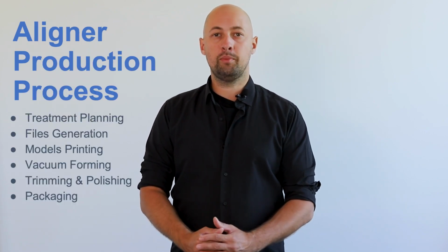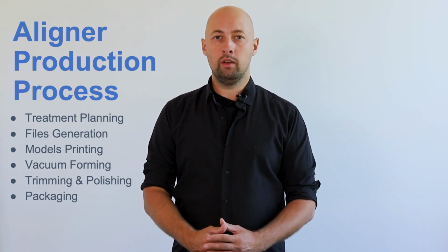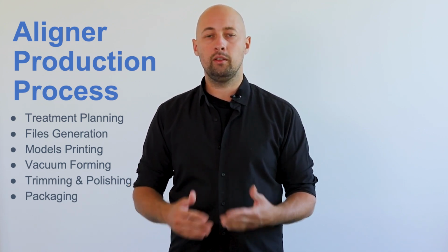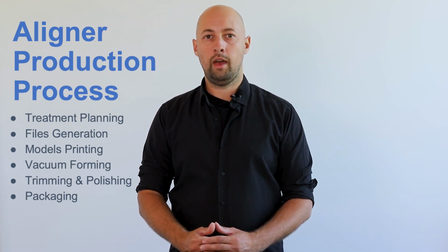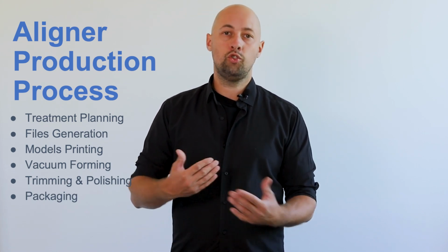So the aligner production process as we know it nowadays is the following. Start with the treatment planning, then after the approval we generate the files according to the needs of the customer. It could be a hollow model, the solid model, vertical printing, horizontal printing, supports, everything that you need to have in terms of the 3D printing. Then you vacuum form your models, trim them, polish them, and package them.